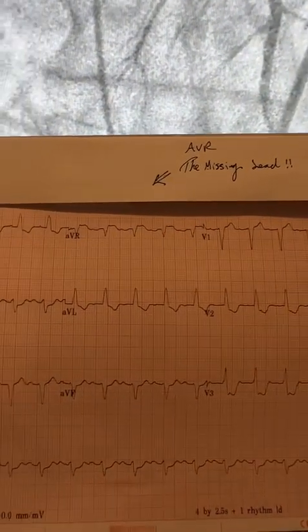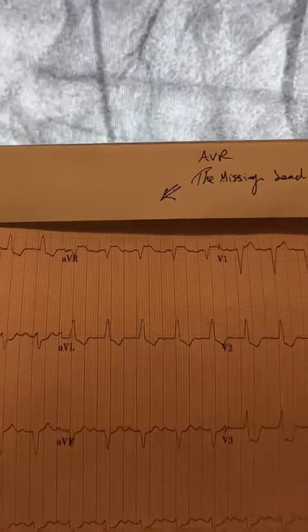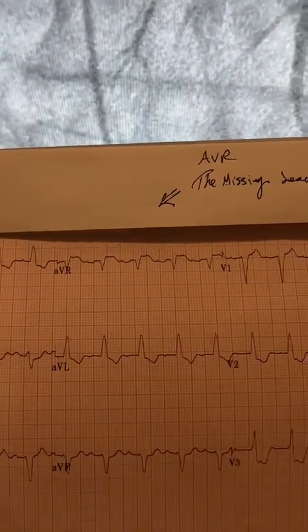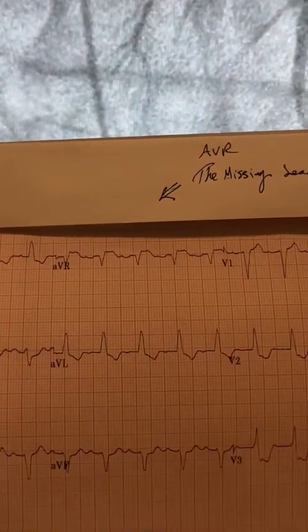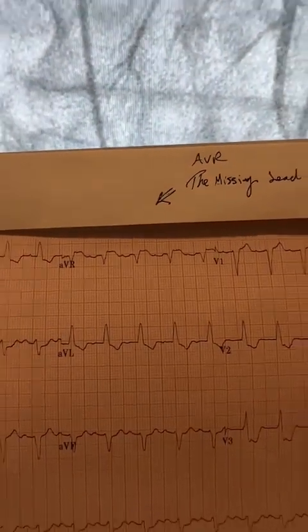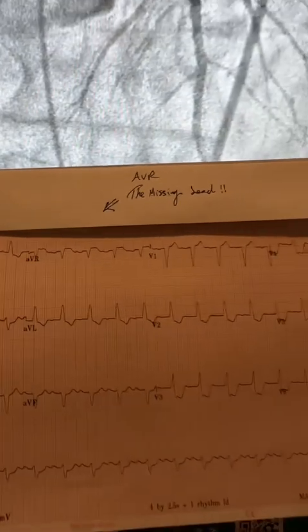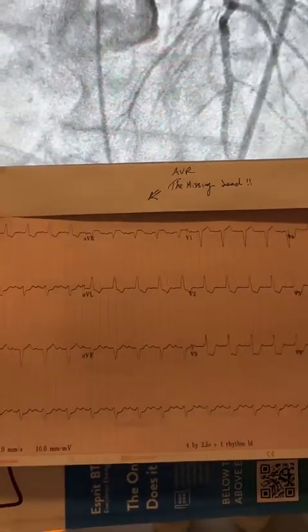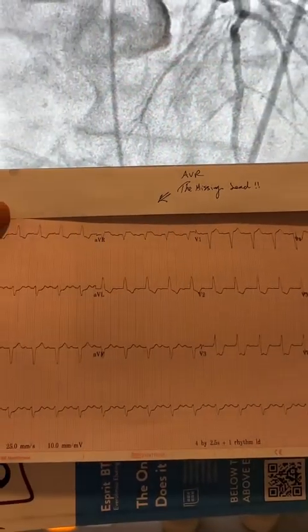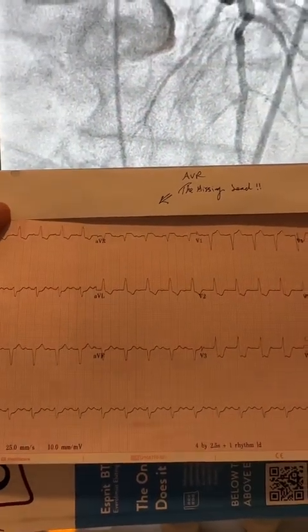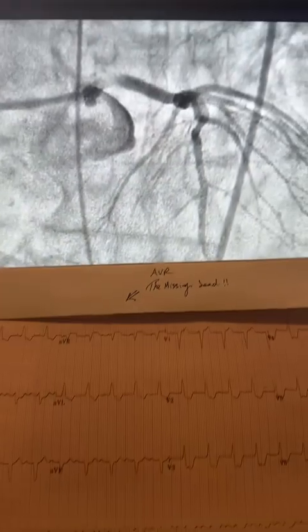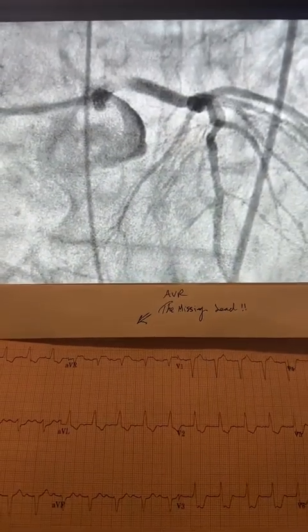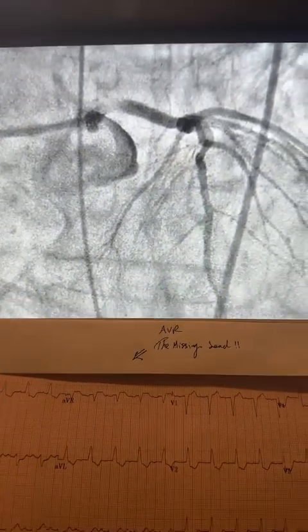Look at the AVR. There is some ST elevation in AVR — we call it the missing lead — and there is diffuse ST depression. And here is the angiogram of the left main.